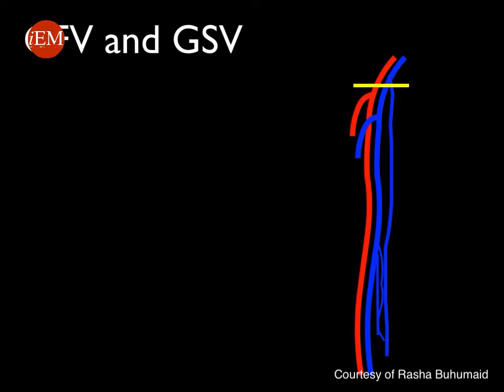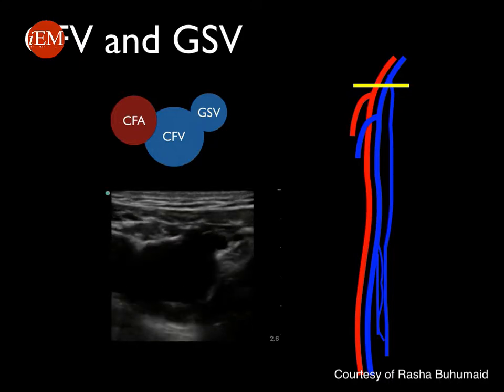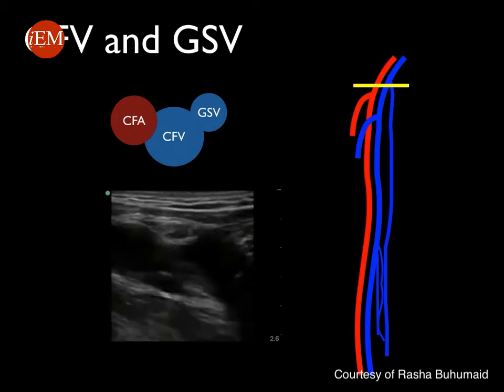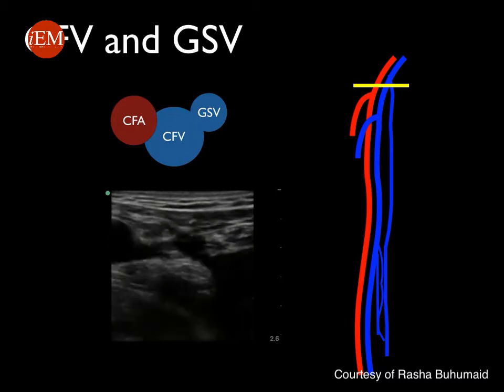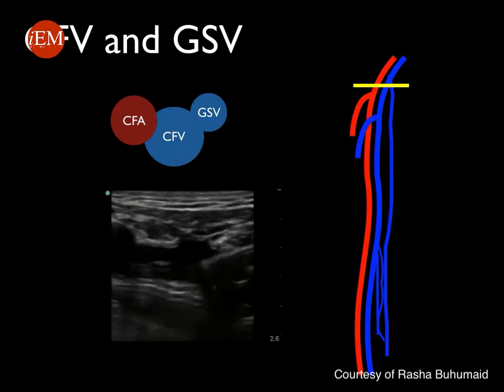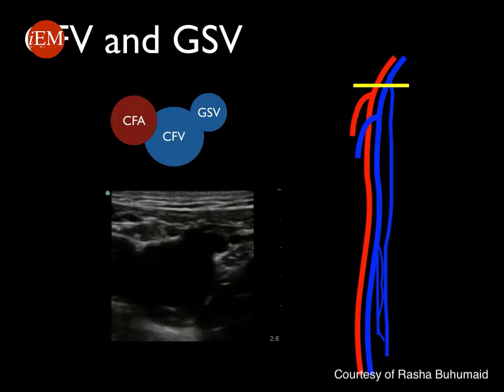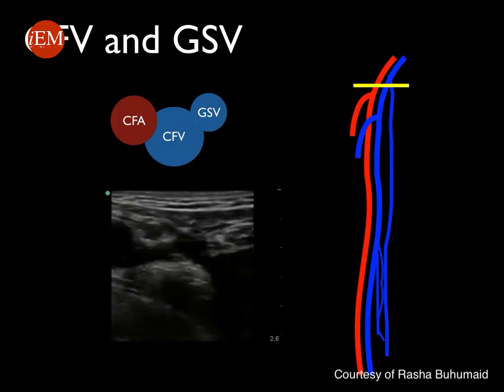At the level of the common femoral vein and greater saphenous vein, the vein lies medial to the artery, producing what is known as the Mickey Mouse sign. You will see the greater saphenous vein draining into the common femoral vein medially, with the common femoral artery located laterally. The venous system is compressible under probe pressure while the artery remains non-compressible, which is normal.